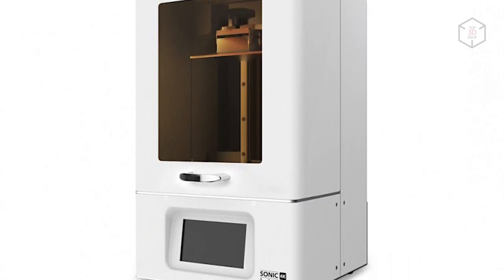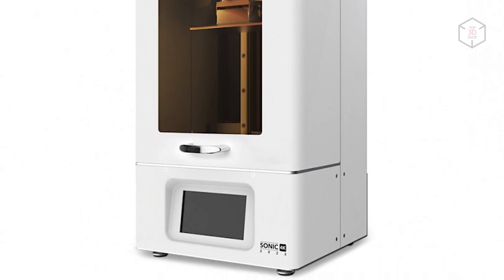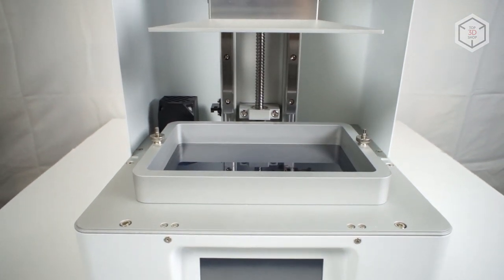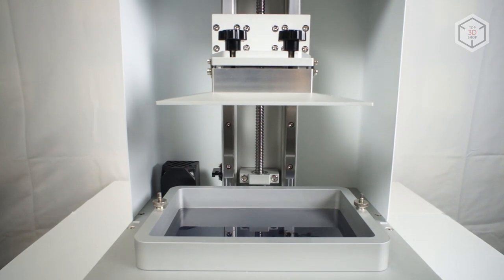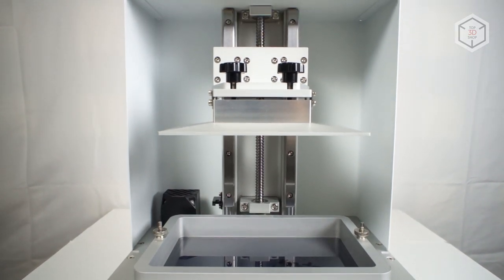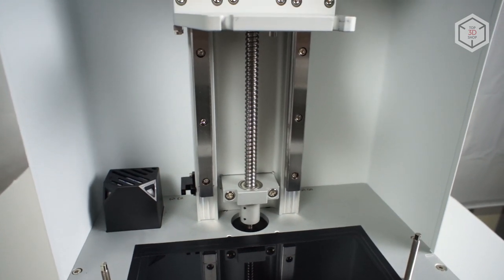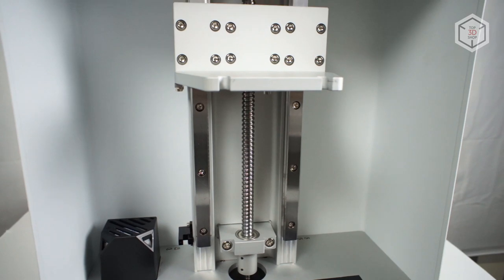This does not affect performance in any way, but without the plastic grills on the sides, the printer looks more appealing. The underlying mechanics of the printer are exposed when opening the front door. The Z-axis moves on two 15mm rail guides driven by a ball screw fixed on bearings from below and above. The stepper motor is installed inside the body. In this version, the optical end sensor responsible for homing the Z-axis is located at the machine's bottom.